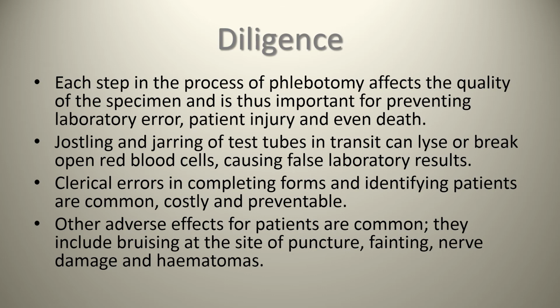So let's watch now the video that goes along with this presentation. We're going to show two videos. The first video is going to basically demonstrate the collection of blood using the standard Vacutainer needle holder and needle as one piece. The second video describes how to use the butterfly tops.